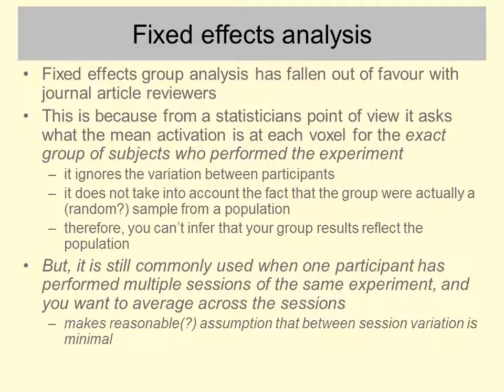And in that case, it's probably a reasonable assumption, given that you haven't even taken them out of the scanner, that variation between the scan sessions is fairly minimal. Maybe if it was on different days, it would no longer be a reasonable assumption, and it'd be better to model this factor as a random effects factor.